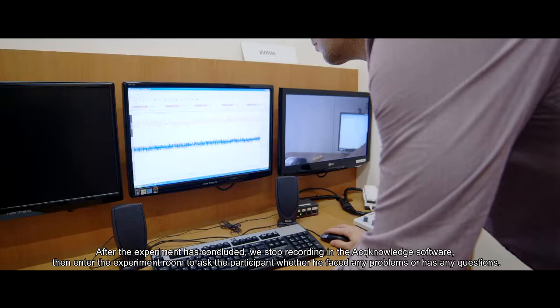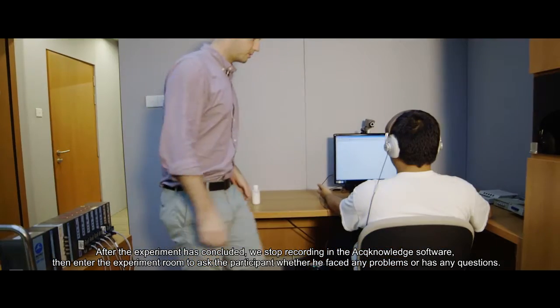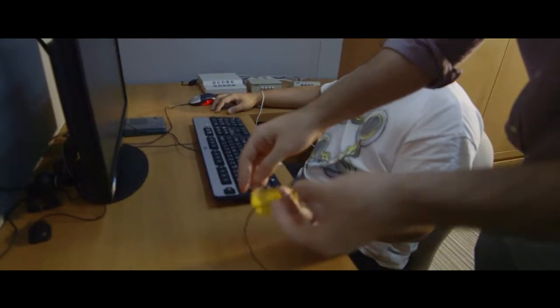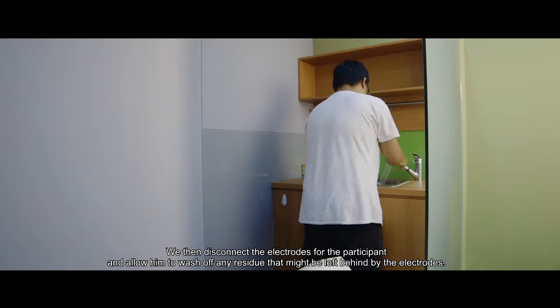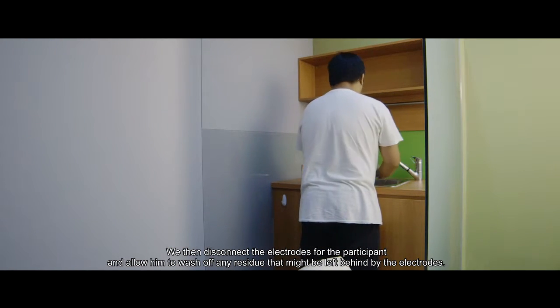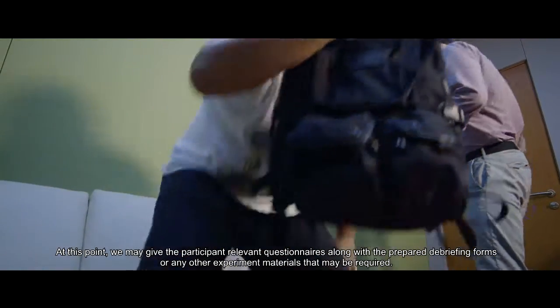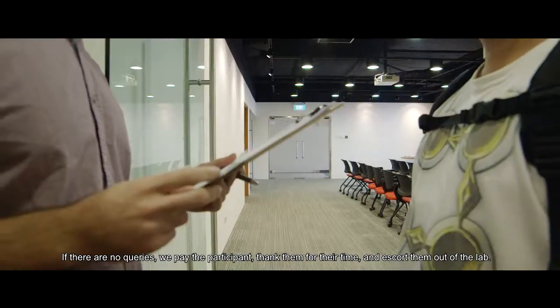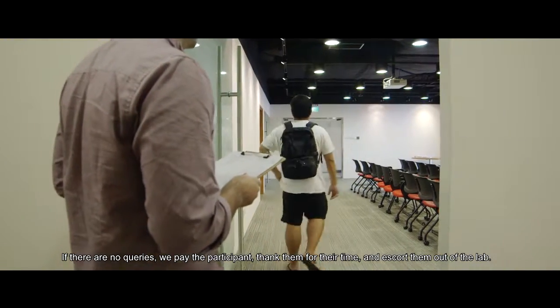After the experiment has concluded, we stop recording in the Acknowledge software, then enter the experiment room to ask the participant whether he faced any problems or has any questions. We then disconnect the electrodes from the participant and allow him to wash off any residue that might be left behind by the electrodes. At this point, we may give the participant relevant questionnaires along with prepared debriefing forms or any other experiment materials that may be required. If there are no queries, we pay the participant, thank them for their time, and escort them out of the lab.